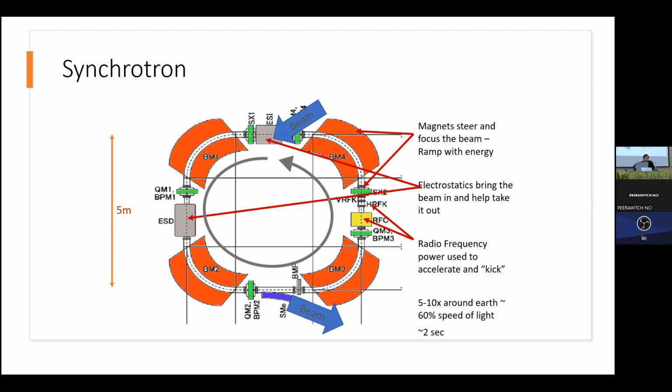So in a synchrotron, the way it was done before is you'd have single energy extraction, meaning you get that one energy, you treat with that one energy, and then any protons you had left over in your accelerator, you had to dump them, refill it, re-accelerate them to the next energy level, and then treat. That was single energy extraction.